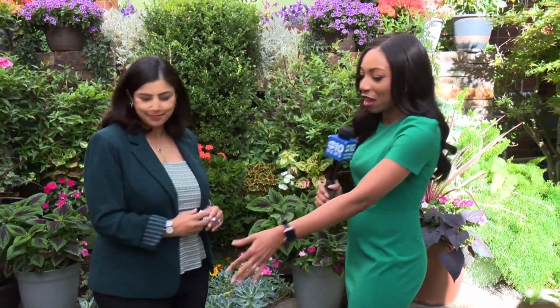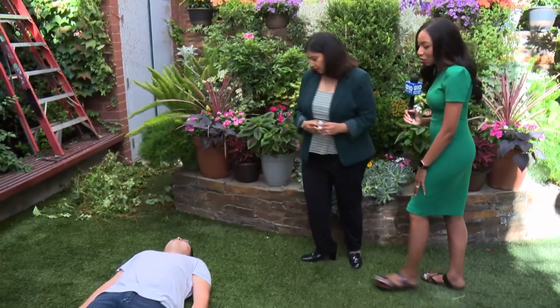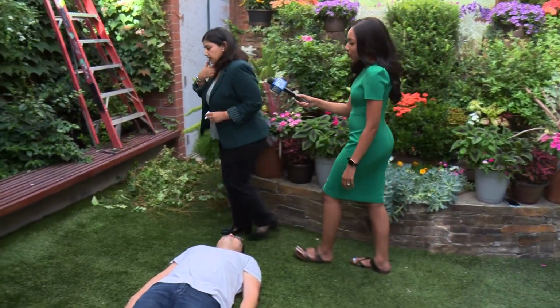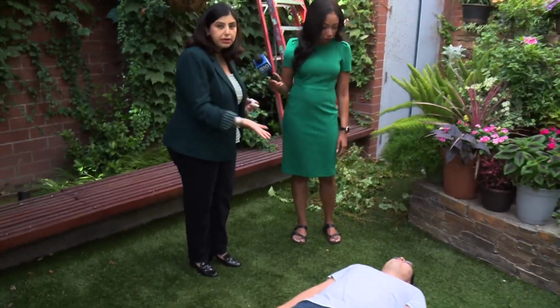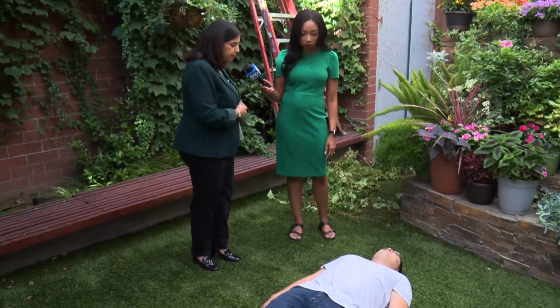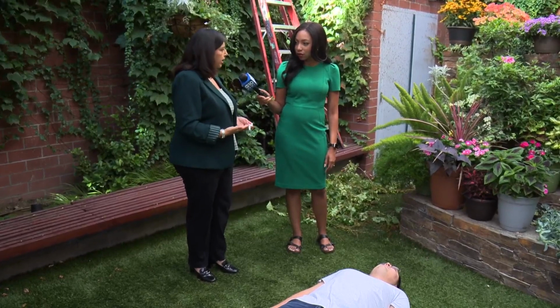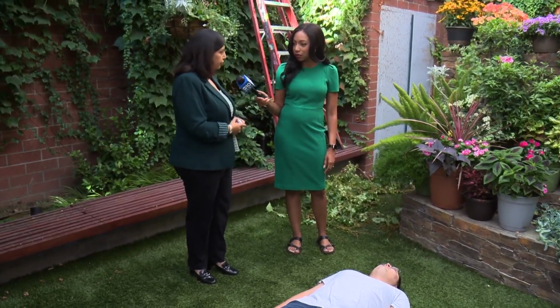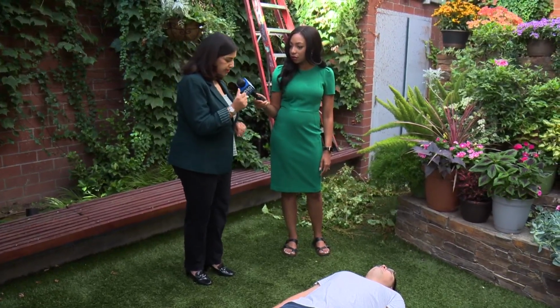So let's talk about how to administer it. Brandon, our editor here, was so kind to agree to help us with this. Let's do a demonstration. Can you just walk us through? Sure, yeah. So if you see someone on the ground and they are unresponsive, you can look at their pupils, see that they are pinpoint pupils, they're breathing really slowly, and you think that there's an opioid overdose, then you can definitely go ahead and do this nasal spray.